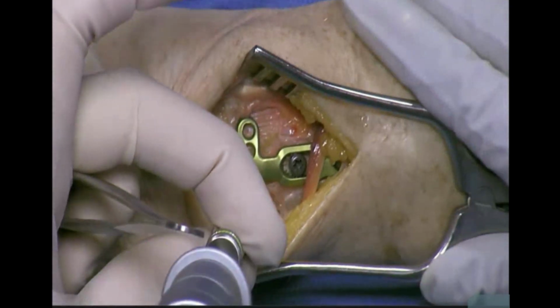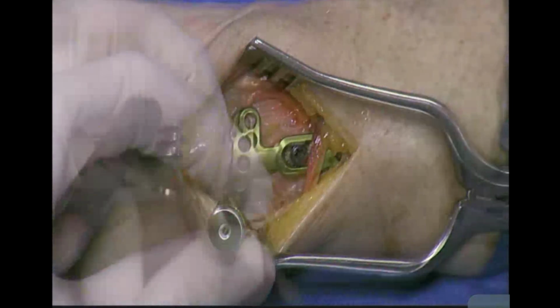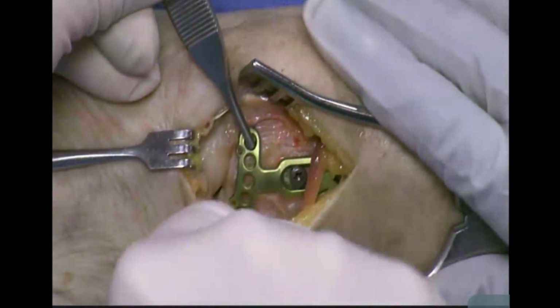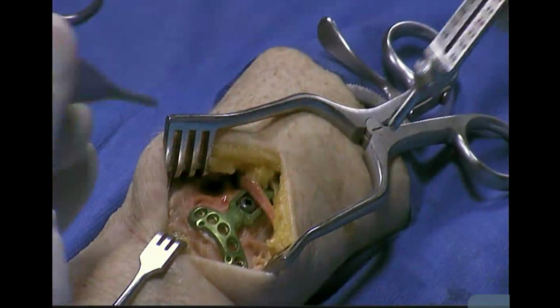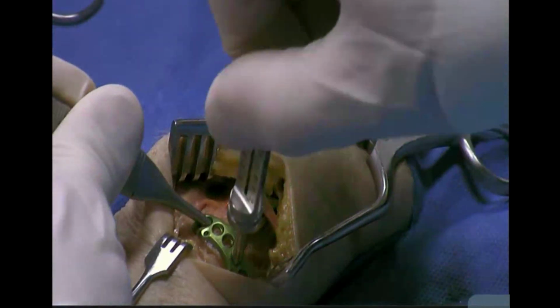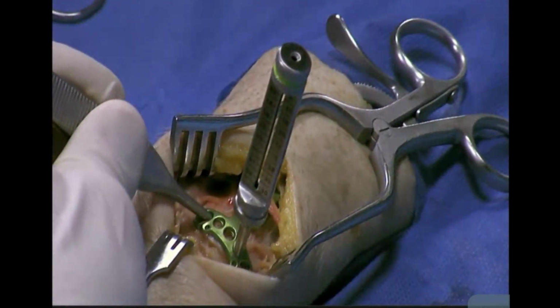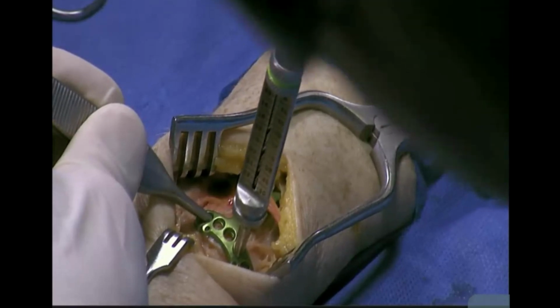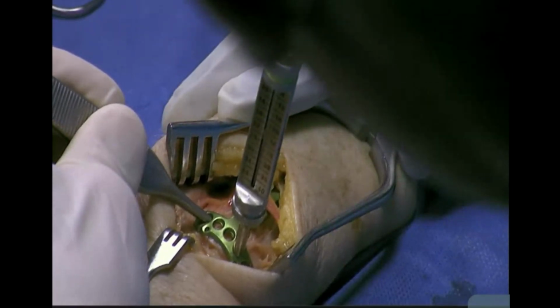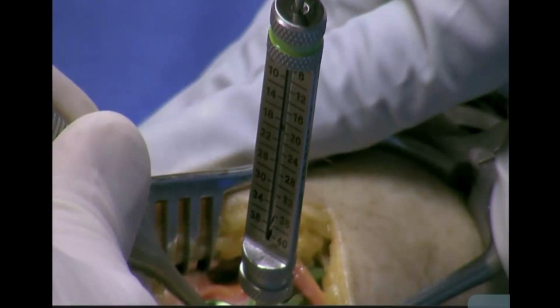So with several ways to put these in. So second, we'll stay on the scaphoid facet. Use this drill guide. Drill is also calibrated. You can use a regular depth gauge or the drill guide. So our volar cortex measures 19, and we'll put in a 20 screw.